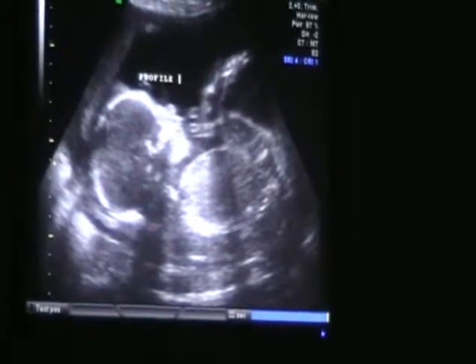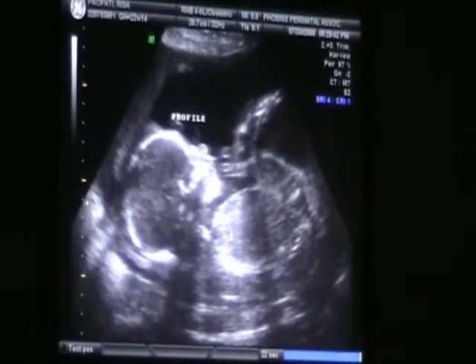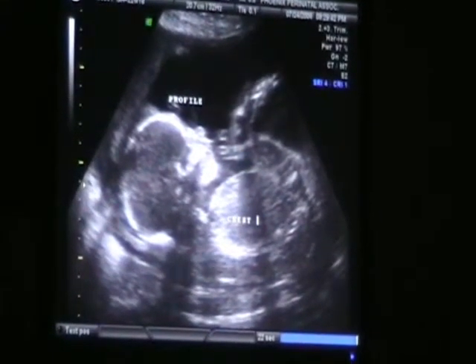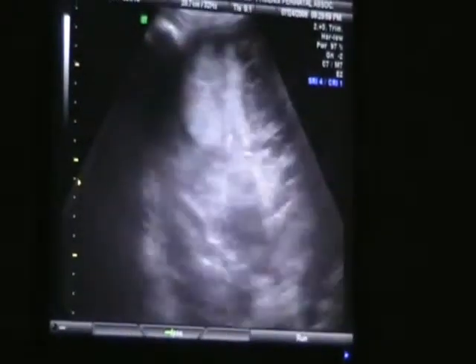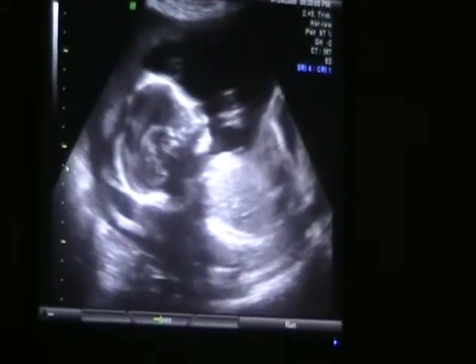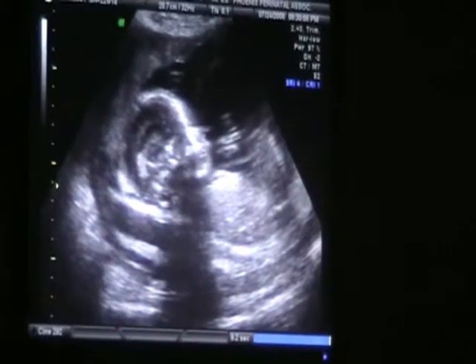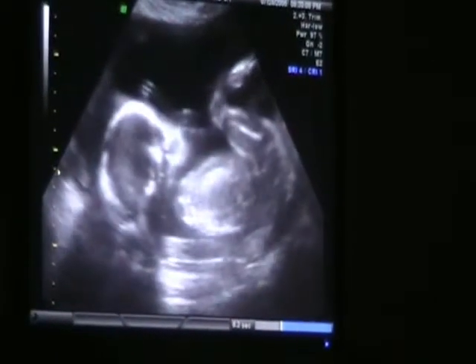Here's a profile. Here's the chest. Now this little one is breech right now. She did like that last time. Let's see if we can catch her one more time and I'll get a little video clip on her. There she goes. That's what I want to see. Yeah, put it on a CD. We'll catch her moving.